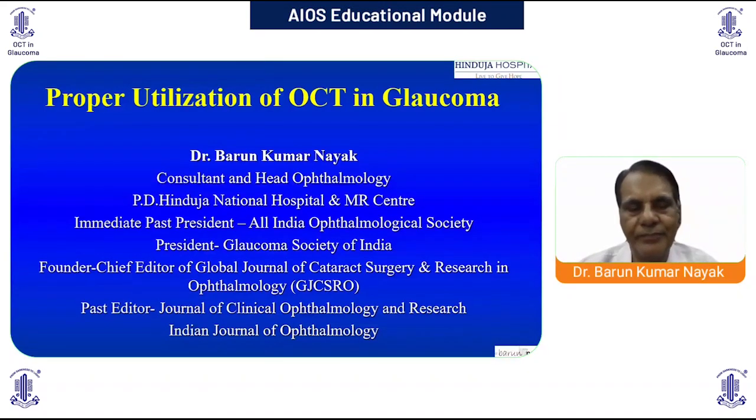Hello, everyone. The topic given to me today is to highlight how I use OCT in relation to glaucoma. OCT has become a useful tool in glaucoma diagnosis and management, provided it is used properly. As per my personal observation, OCT in glaucoma is perhaps the most abused machine in ophthalmology.